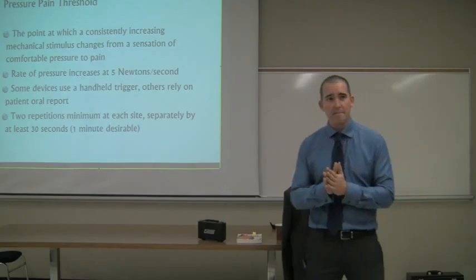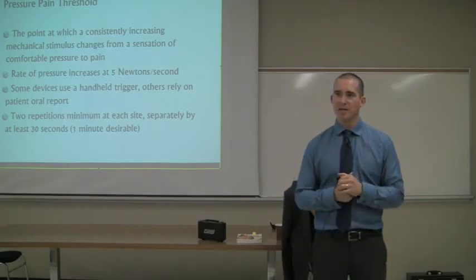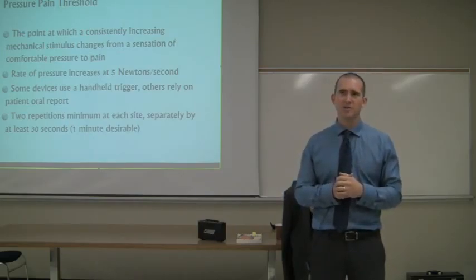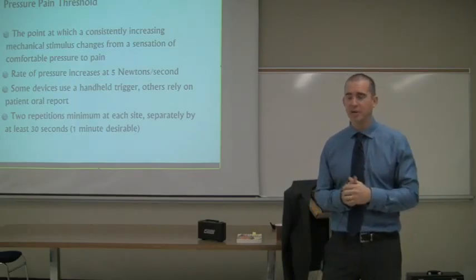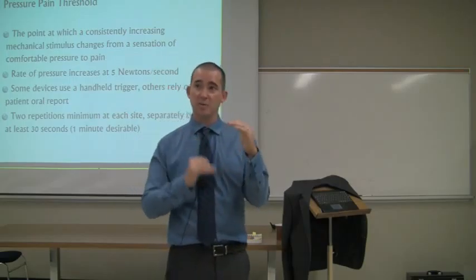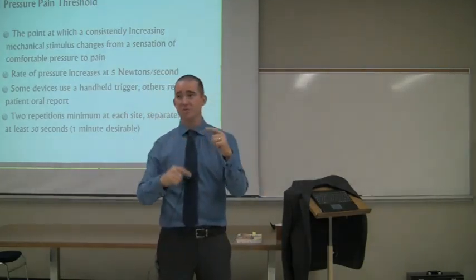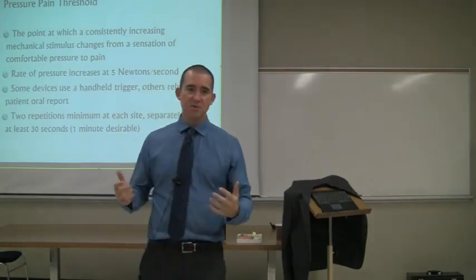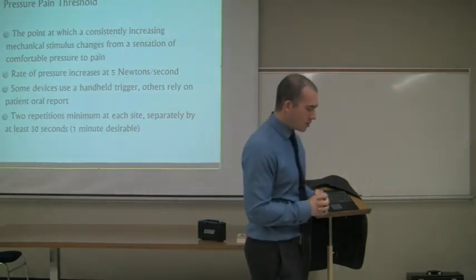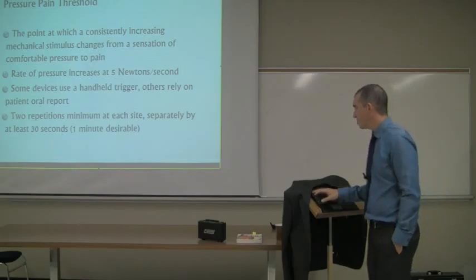Normally you would do a minimum of 2 repetitions per site. As I say, usually the first time someone has this done, there's this sort of calibration occurring. That's pressure, is that pain? Not really sure. Oh yeah, that's definitely pain. The second time, more often than not, what I've found is that the second time is actually dramatically lower. And then if I have to do a third time, it usually sort of is midpoint between the first two. No real reason for going beyond 3, as far as I'm concerned. You could get away with 2 if the first 2 are very similar.